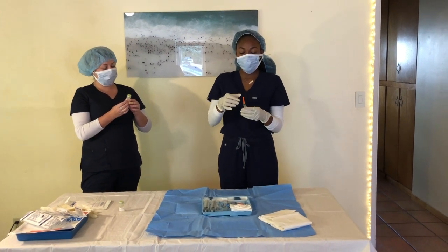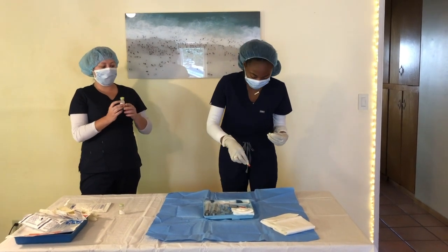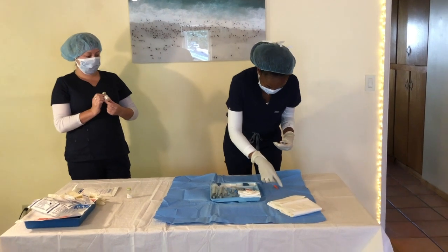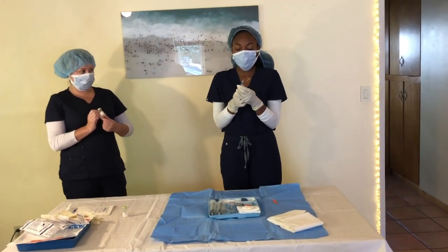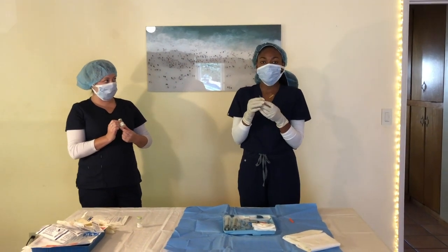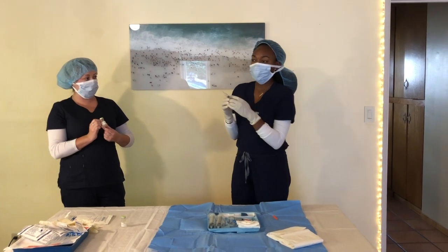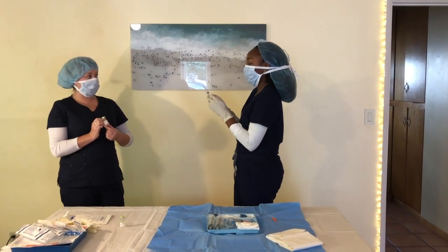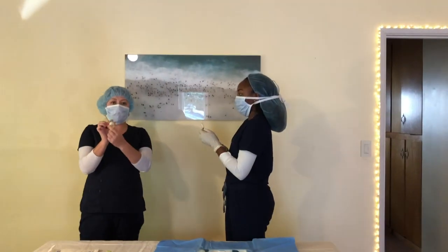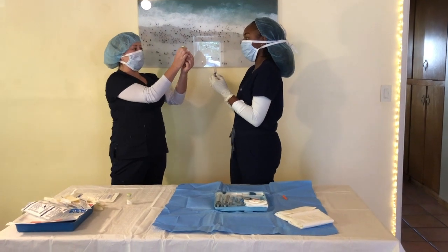And then I'm gonna make sure that I just twist the orange off and pull. And then I'm going to set it here to the side, still close to the center. So I like to draw up 3 cc's of air first, because that's how your syringe will automatically draw the same amount of liquid. I'm going to have Tegan check the date for me, please, and pop off the cap. So I will tell her what I have in my hand and show her the expiration date physically, so that there's no confusion.